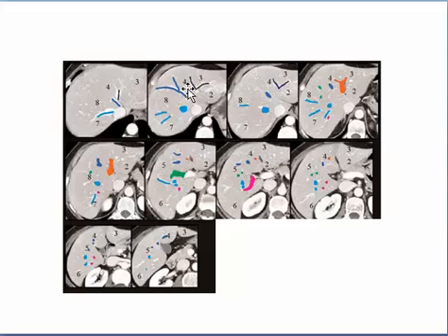Then if you are in high cuts, you will find 7 and 8, but in low cuts you will find 5 and 6. So 2, 3, 4, 4, 5 and 6, then 7 and 8. What makes it is the cut level.